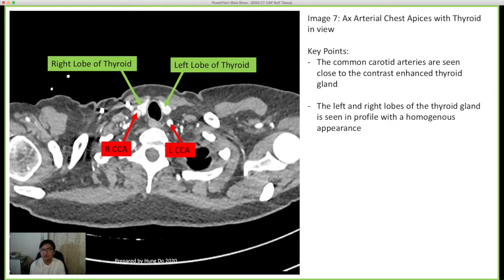So in nuclear medicine, there is a particular test called iodine 131. This test uses iodine, and iodine goes to the thyroid. So if you give the patient a load of contrast injection, that will go to the thyroid, and the thyroid may not pick up the iodine 131 very well, if at all. So therefore, the patient has to wait X amount of weeks until it is deemed safe or effective for the patient to have this treatment.